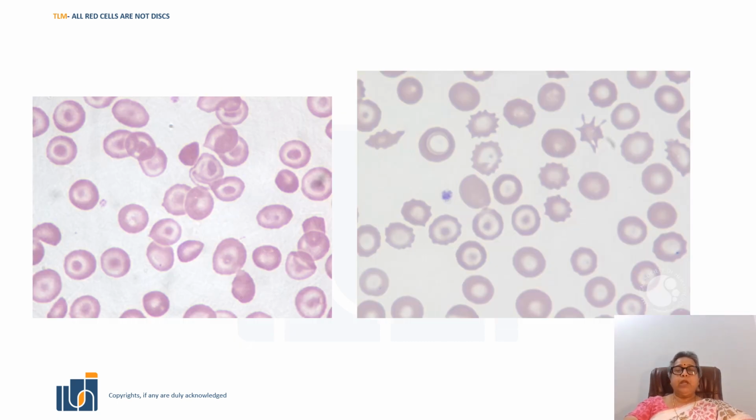Let me show you. Now, these are large target cells or macrocytic target cells. See the macrocytes. You can see scattered macrocytes, and you find lots of target cells. I've also included an acanthocyte for your benefit and an echinocyte for your benefit. So this is liver disease. Okay. Whereas compare the two targets. This is nice. This is normocytic. You have a few which are microcytic also, and these are because of hemoglobin E disorder.